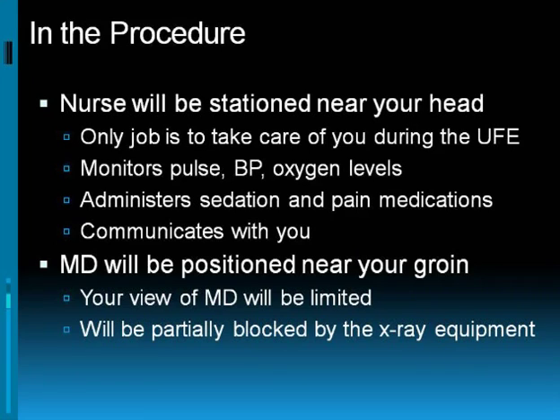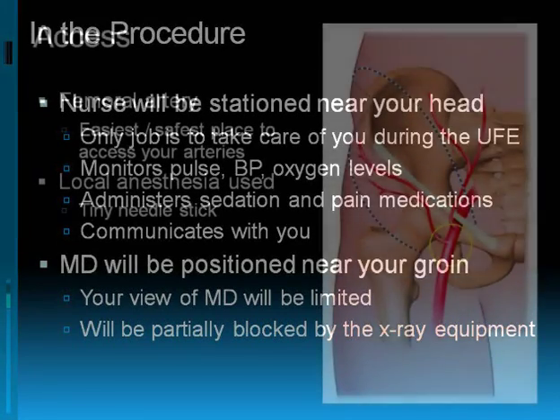And they'll be communicating with you, making sure you're fine during the procedure. The physician actually doing the procedure will be positioned down by the groin, and in many cases you actually will have a fairly limited view of that physician because the imaging equipment tends to block your view of the physician.